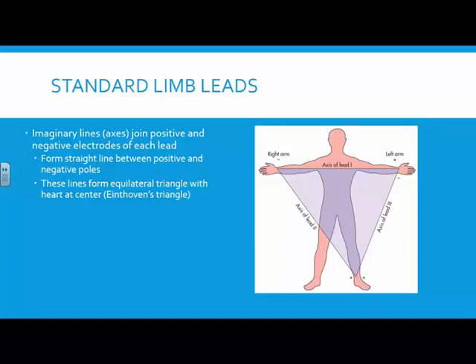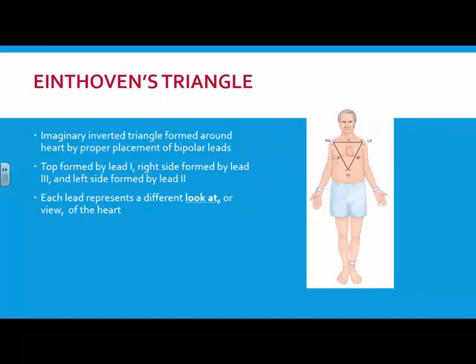Alright? Now, Einthoven's triangle, that's what that forms right there.